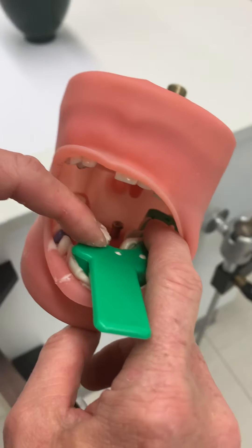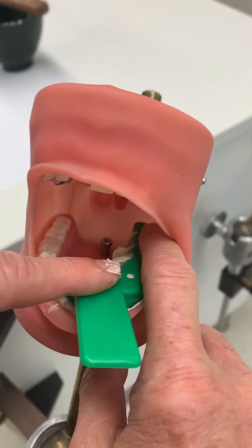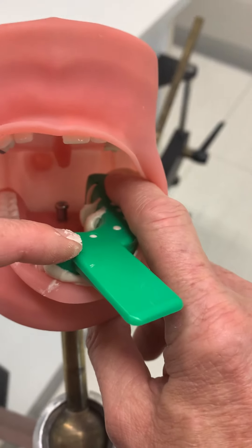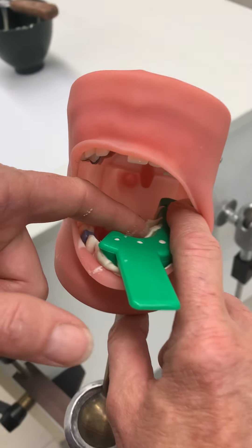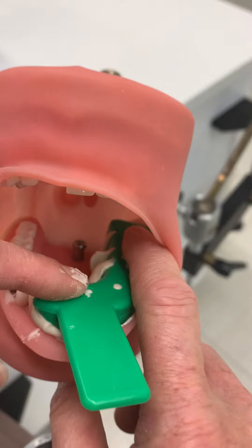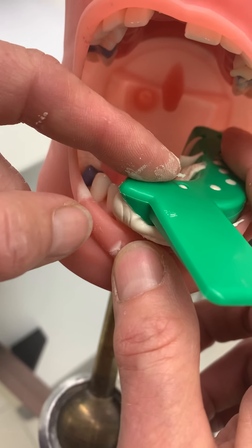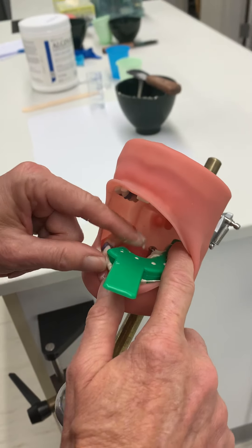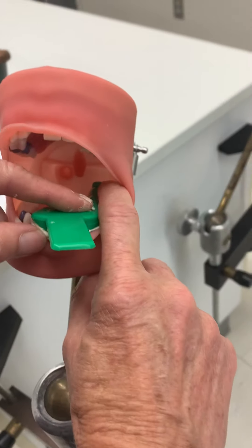It's very important that we seat the tray securely from the distal to the midline anterior area. As I'm holding, I can make sure my patient is comfortable. I'm checking the material — it still seems like it's not quite set but it's getting there. I can also check it in the anterior portion; I should be able to put my fingernail in there and not have it make an indentation.